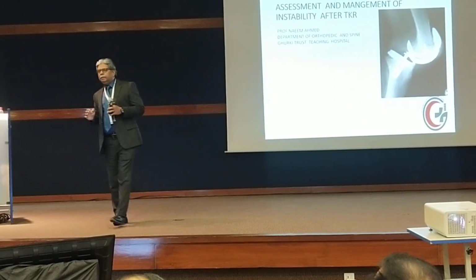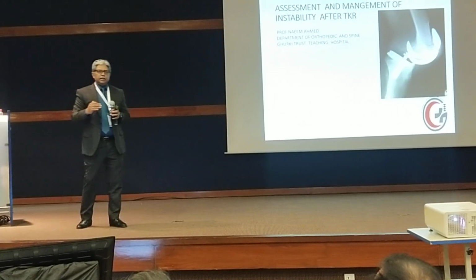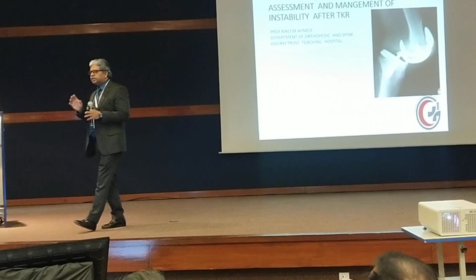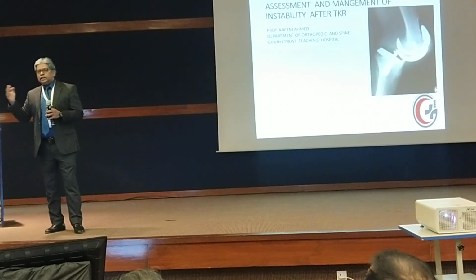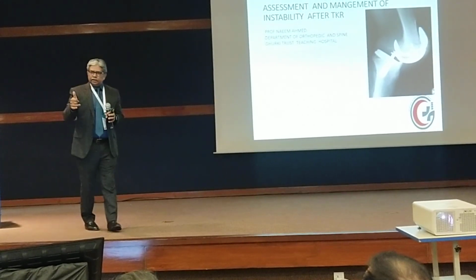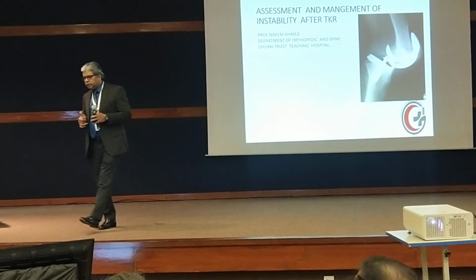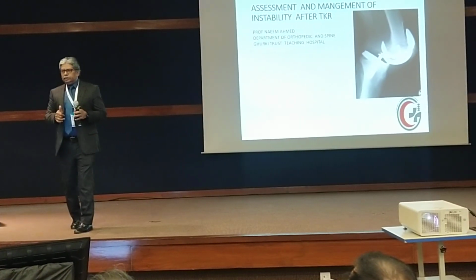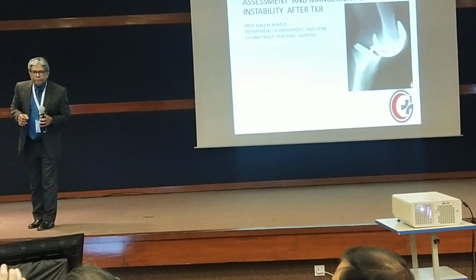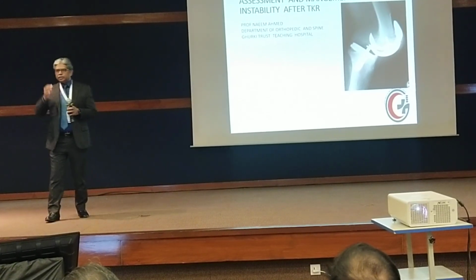और patella की आपने कटिंग प्रॉपर नहीं की या उसको अंडरकट किया. अंडरकट करने से क्या होगा? अब जब बटन फिक्स करेंगे ओवर स्टफिंग हो जाएगी. ओवर स्टफिंग से क्या होगा? Lateral retinaculum would be tight and again dislocated. So undercutting of the patella and faulty placement of the femoral and the tibial components lead to patellofemoral problem. एक और बचा, lateral placement of the button. Yes, lateral placement of the button. And that completes everything.